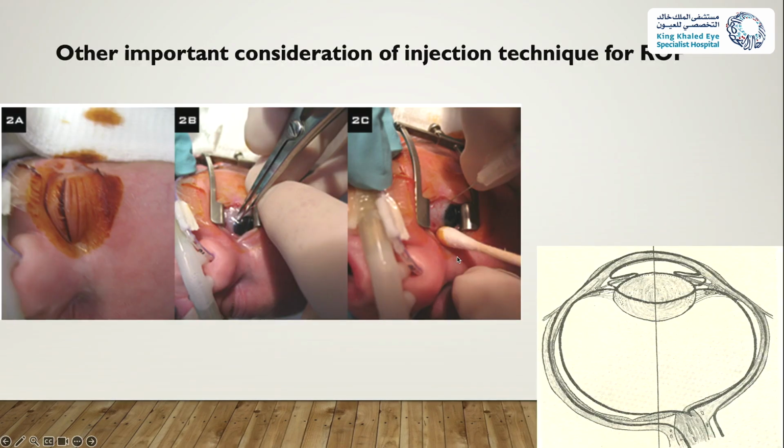For the pediatric population, we probably need some kind of difference in the adaptation. I think the worry for the pediatric ophthalmologist is reasonable. You don't want to injure the lens of the baby because it is, on average, thicker than the adult's. So you can see here the schematic showing the adult lens relationship to the eyeball, and this is the children's lens in relationship to the eyeball.